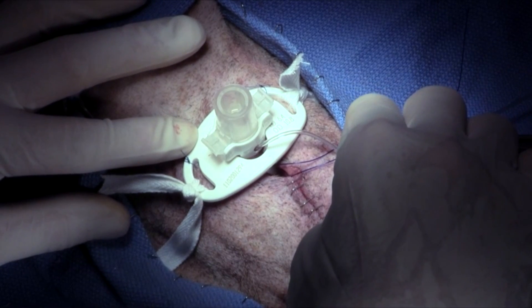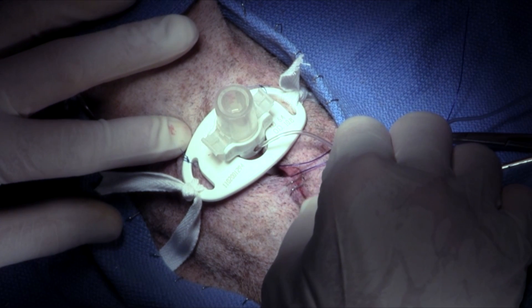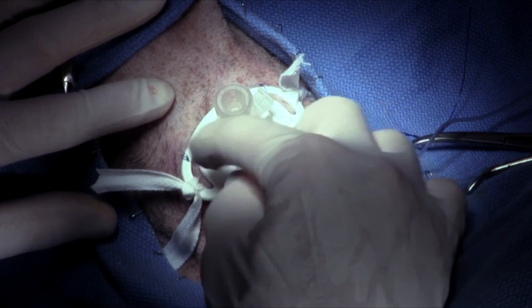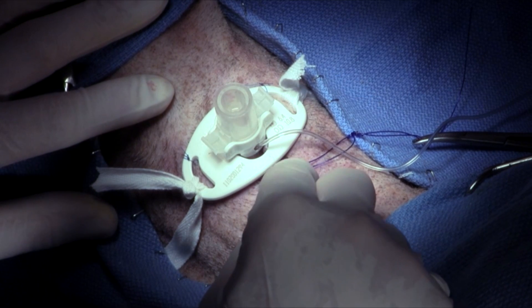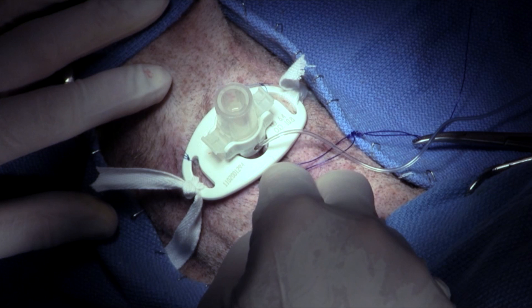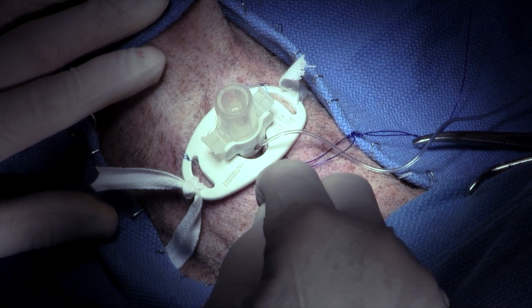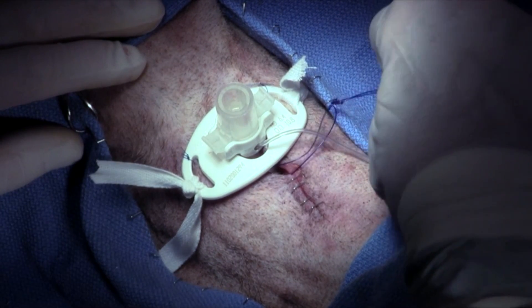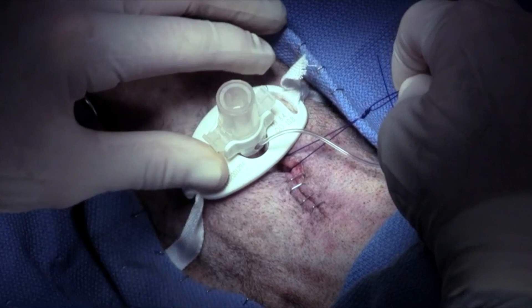The tube is removed within 24 to 48 hours in most cases, in hopes that the inciting disease process has been treated adequately and the tube can be safely removed. The tube is removed after cutting sutures and umbilical tape, and the wound is allowed to heal by second intention. Normal wound care measures — keeping the wound clean and using Vaseline around the skin area to prevent chafing — are necessary. Once the tube has been removed and the animal can ventilate normally, the safety suture can be cut and removed in its entirety.